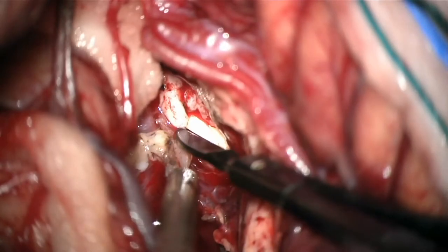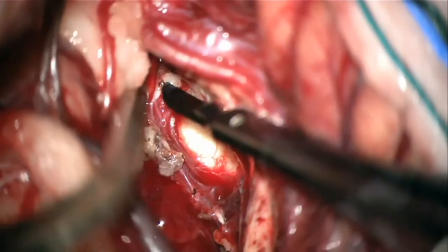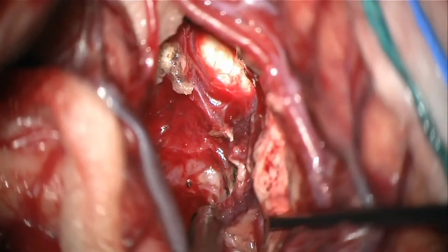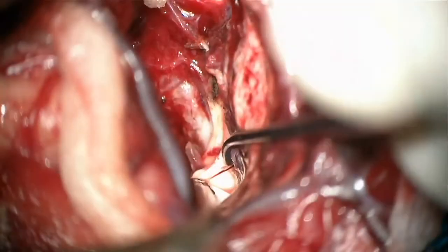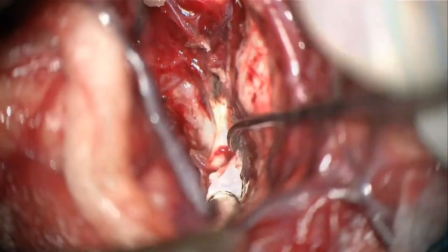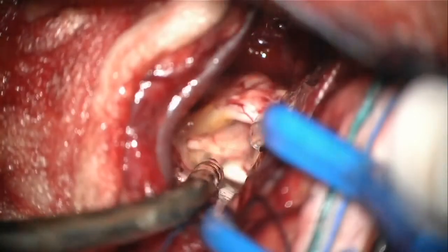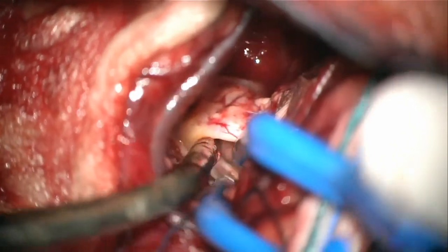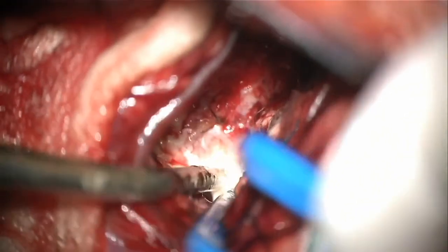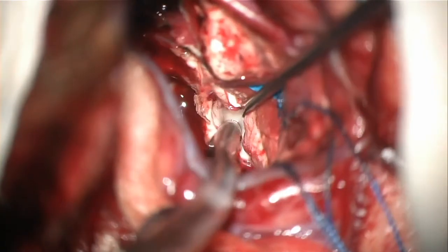We can see again the anterior choroidal artery, as well as the inferior ventricular vein that drains the temporal horn. This is the choroid plexus, and we can see the veins on the roof of the ventricle — ependimal veins. And now I continue identifying the body of the hippocampus, and I can look all the way posterior and see all this enlarged hippocampus, and I can see the posterior aspect of it all the way to the atrium.